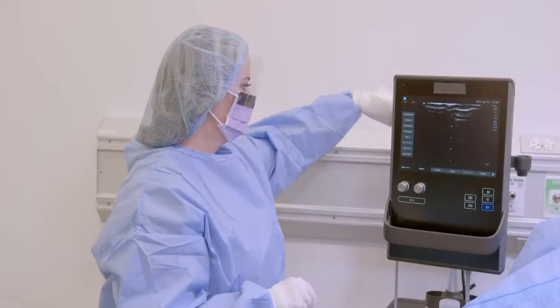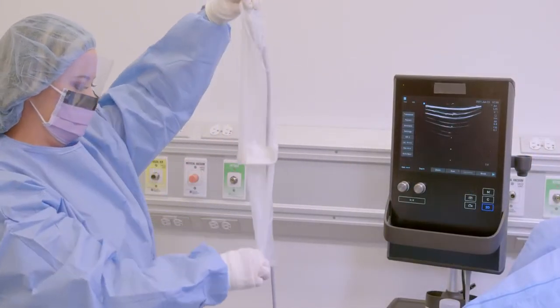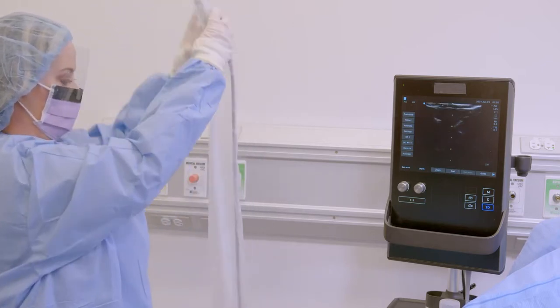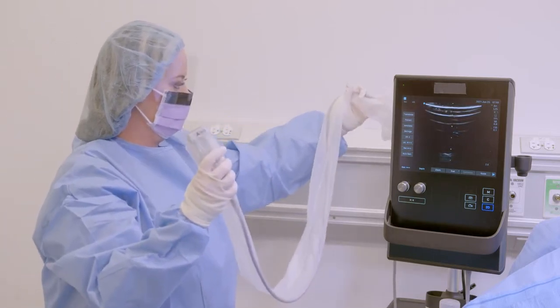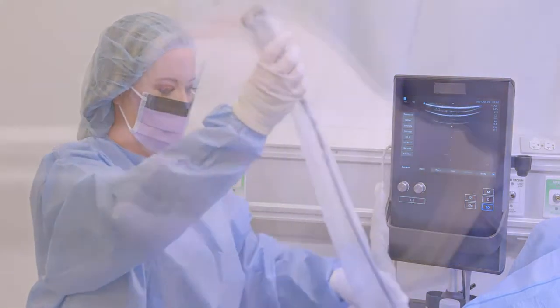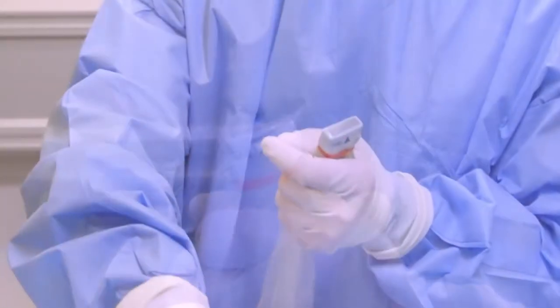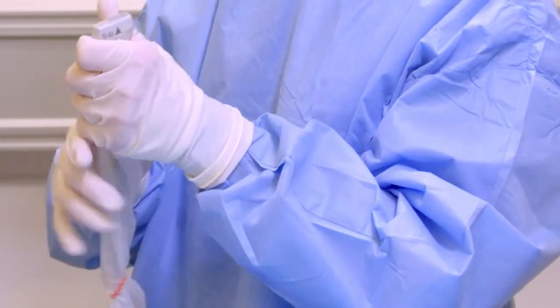Place one hand inside the sleeve as shown and grasp the head of the transducer through the cover. Carefully slide the cover downward, covering the length of the probe and cord. Ensure the closed end of the cover is tight over the face of the transducer. Remove any air trapped between the cover and the face of the transducer by smoothing the cover with gloved fingers. Secure the cover with 1 or 2 rubber bands and place the probe carefully on the sterile field.